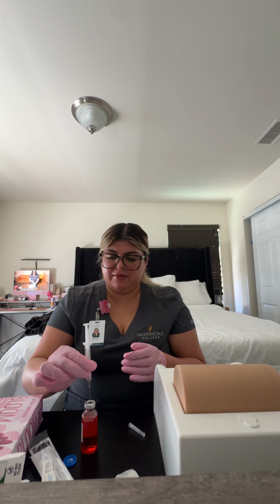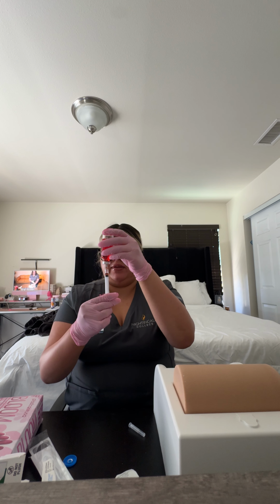Okay, we're going to let that air dry, and in the meantime, we're going to draw up 1.5 milliliters of air into the syringe. Perfect. Going to remove the cap. We're going to inject the air into the vial, and we're going to invert and then draw up the 1.5 milliliters of medication.